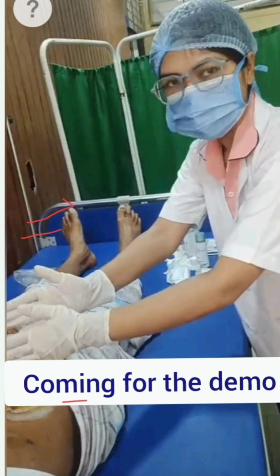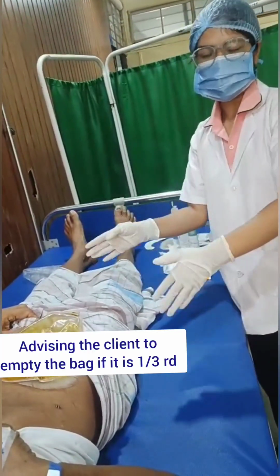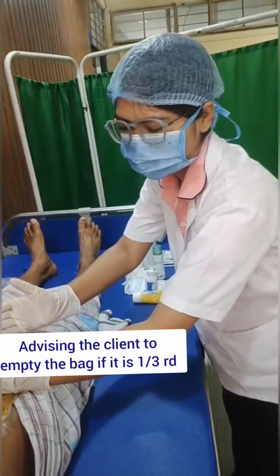So to attach the new stoma bag, I have to put the adhesive gum above the stoma bag. Then we need to place it and hold the bag in such a way for a minute, so that it will give a good adhesion. Then afterward I will put the adhesive tape so that the stoma bag will remain secure and prevent leakage. And at last I will remove the gloves and wash hands again, and I will discard the used items accordingly. Now let us watch the demonstration to understand the steps.